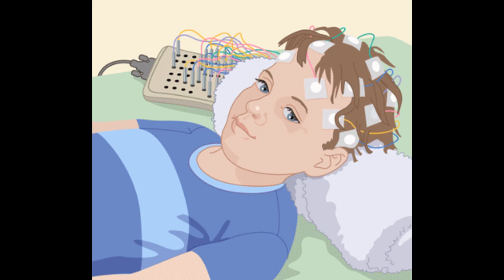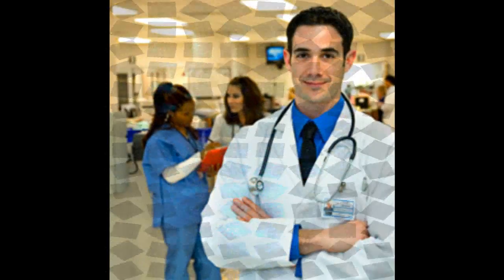Even though the EEG is very safe, if you have a seizure disorder, your doctor might want to stimulate and record a seizure during the EEG. A seizure can be triggered by flashing lights or a change in breathing pattern. If the goal of the EEG is to mimic or produce the problem you're experiencing, the healthcare provider performing the EEG will know your medical history and will be prepared for any issue that may arise during the test.